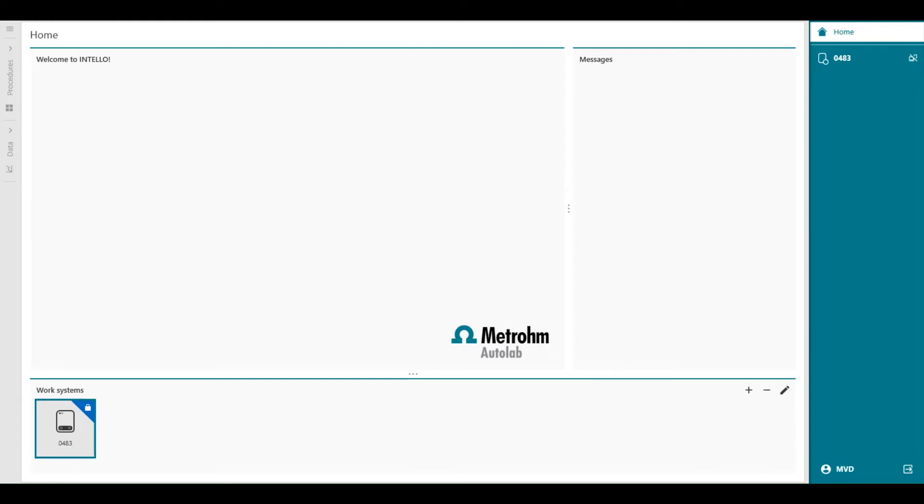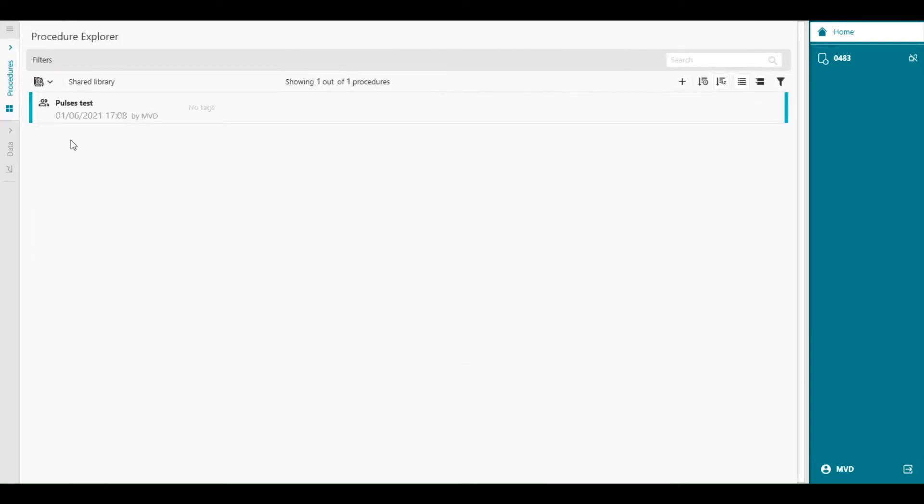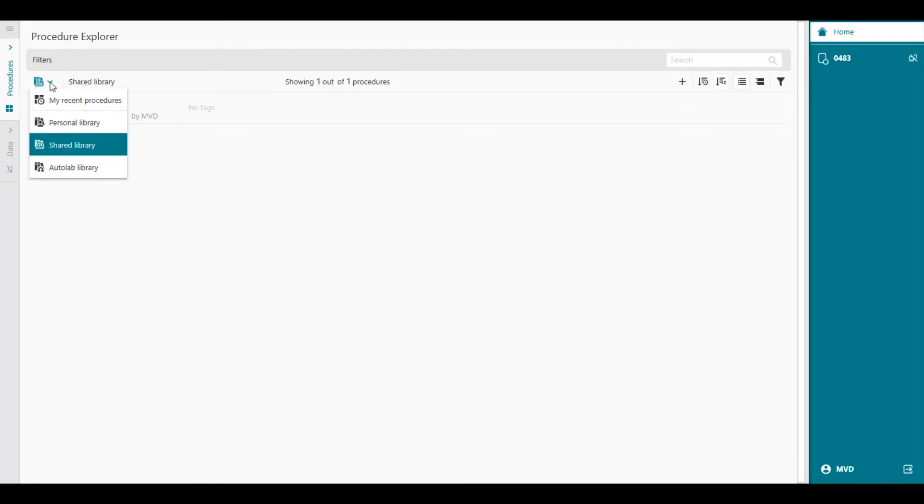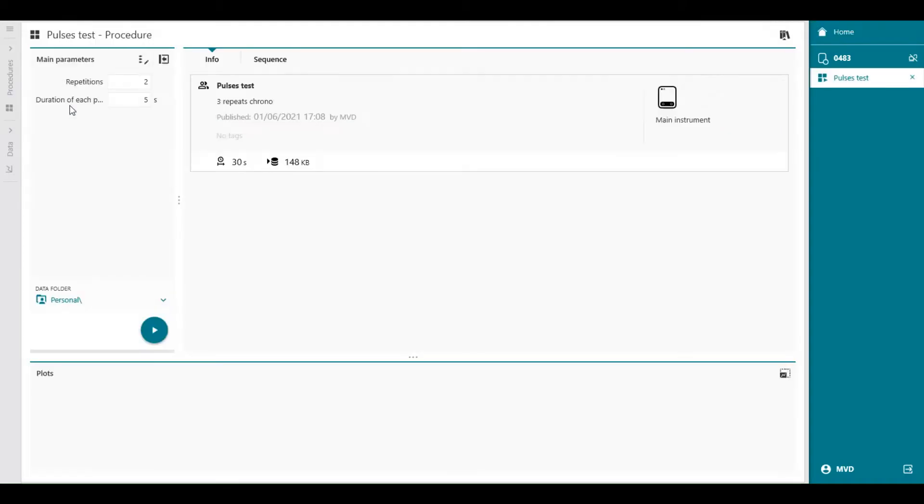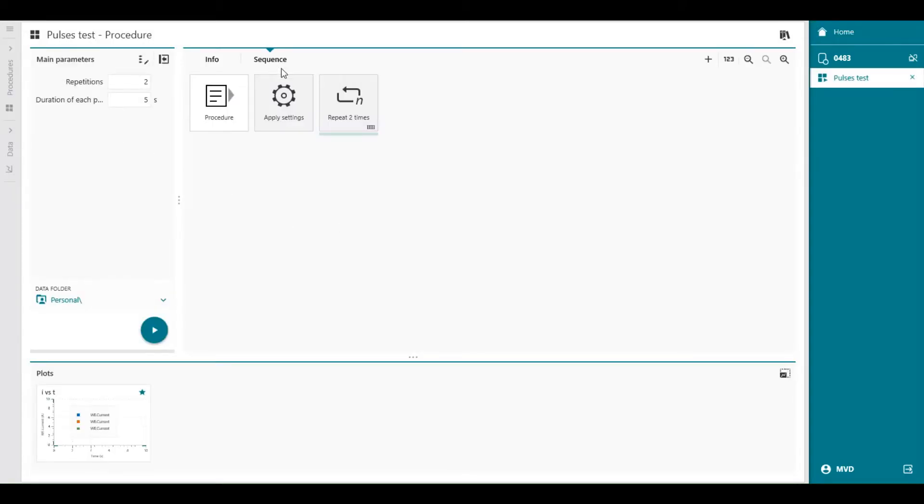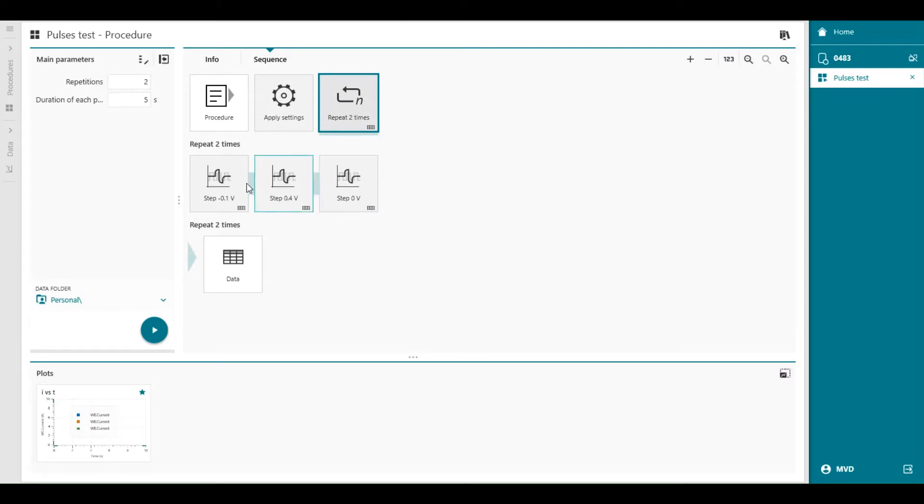Open the pulses in the shared database. So we go to procedures and in the shared database library, you will find the pulses test, which we've used previously. We look at the sequence. And here we'll find the pulses, which we've used.